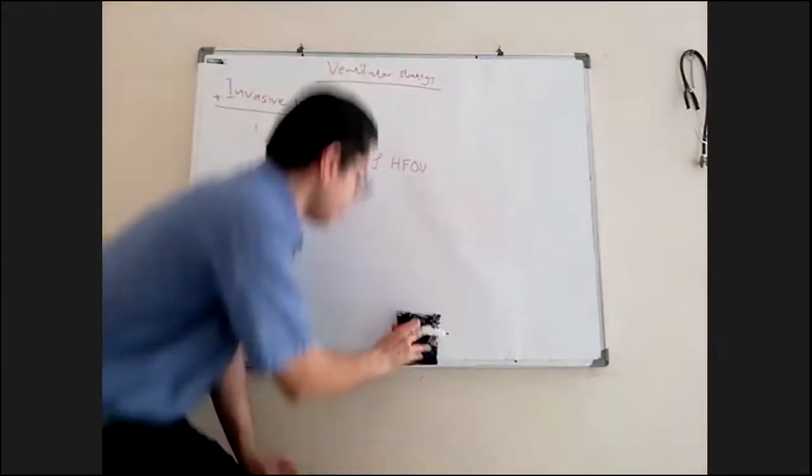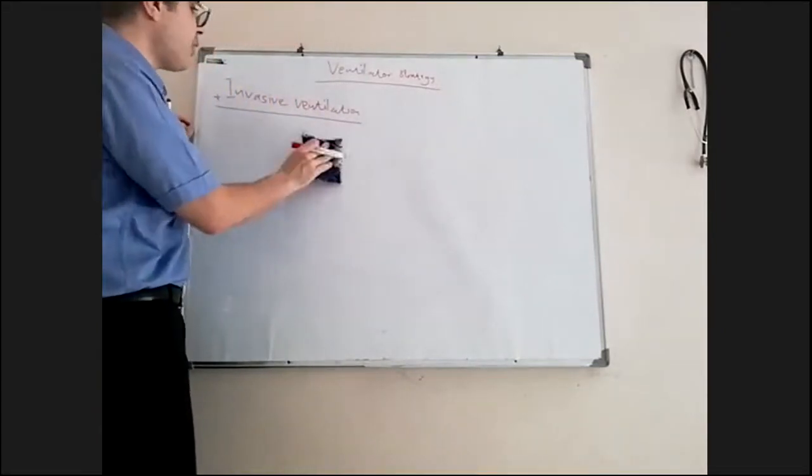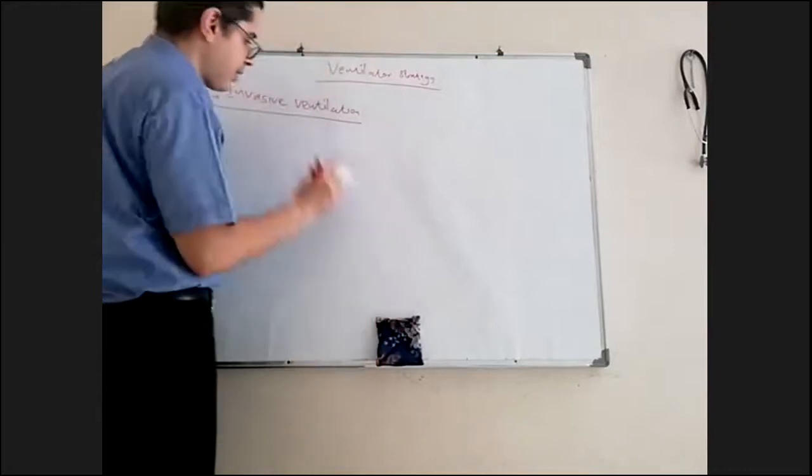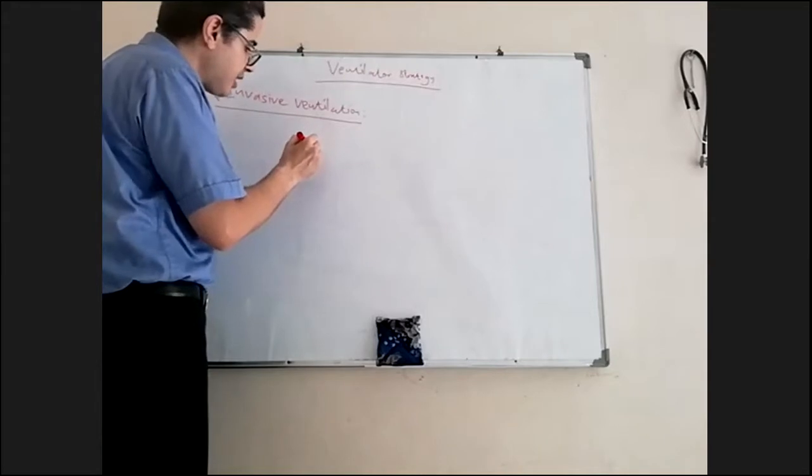Before I go to HFOV, I forgot to tell something regarding the weaning. If your patient is improving on conventional ventilation, you start decreasing the rate.